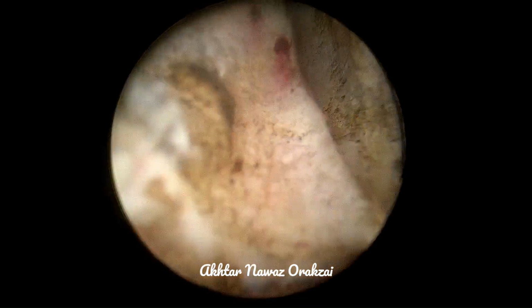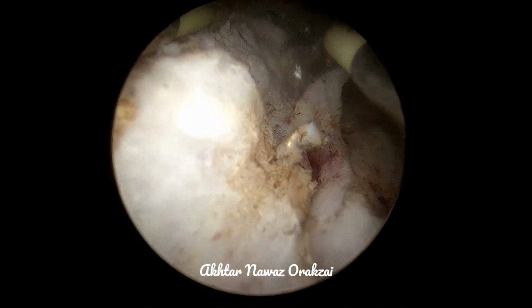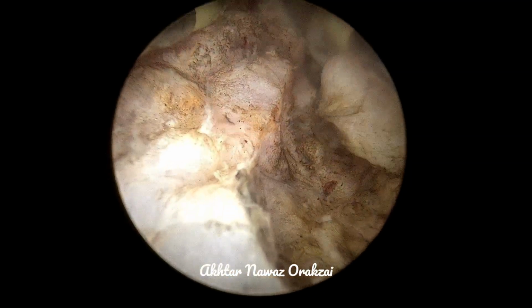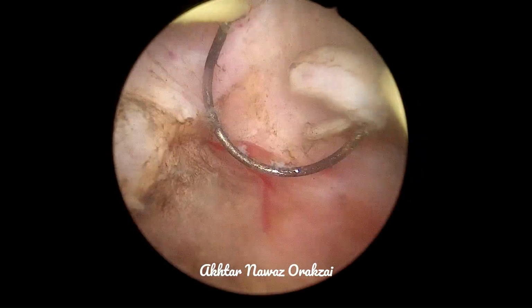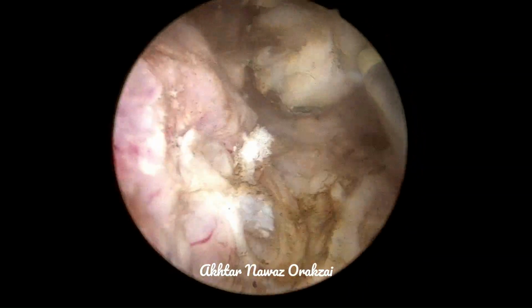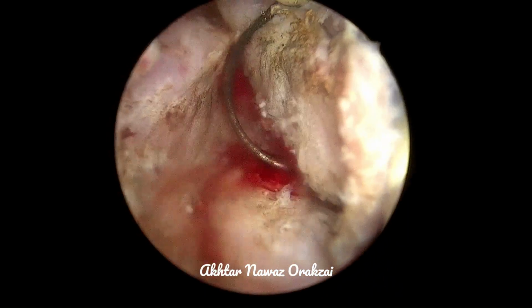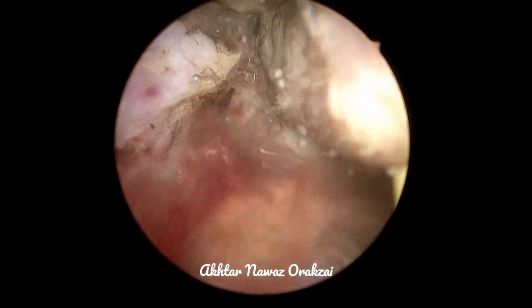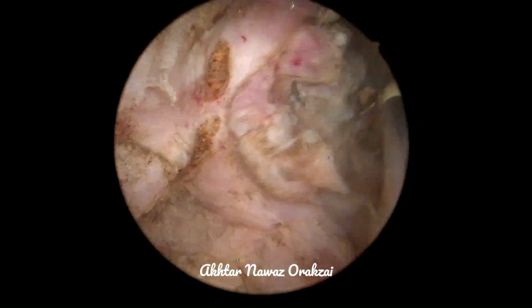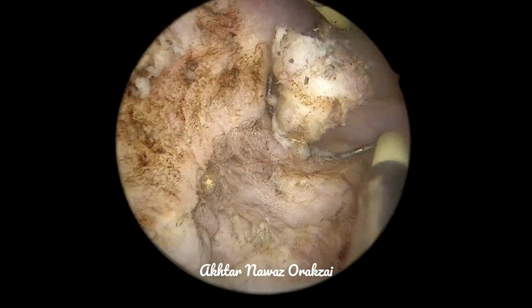So we have emptied the bladder quite a few times with the Ellik evacuator, taking out all the resected chips, and this leads to more and more parenchyma coming into the cavity. As the cavity stretch is reduced, when resection is going on, there is a lot of fluid going in.